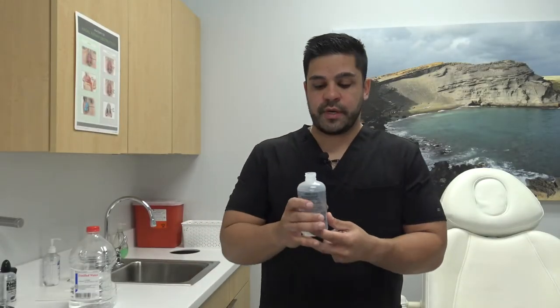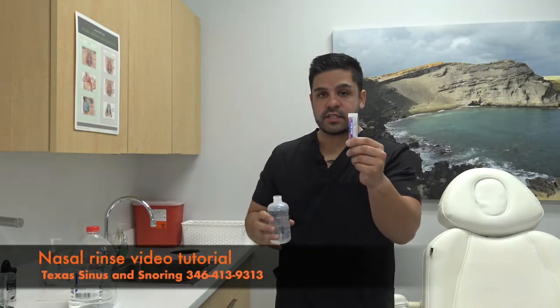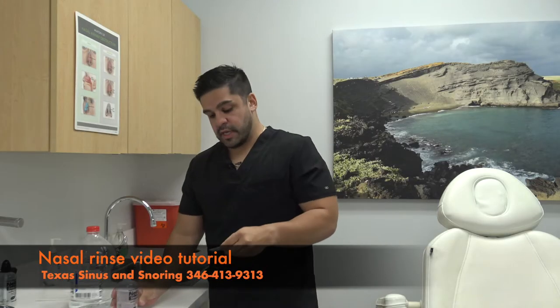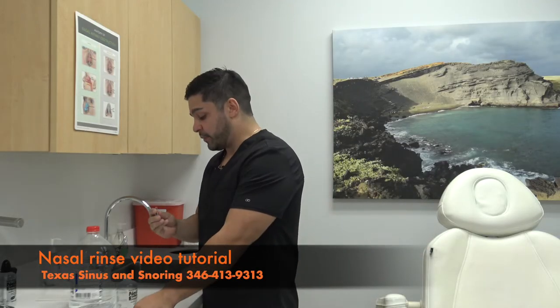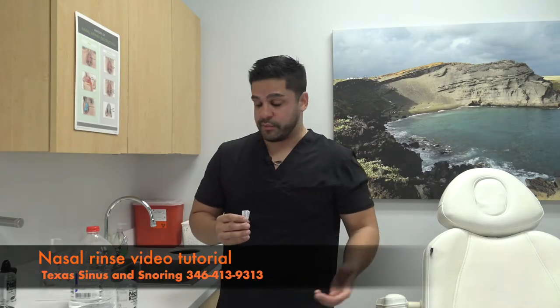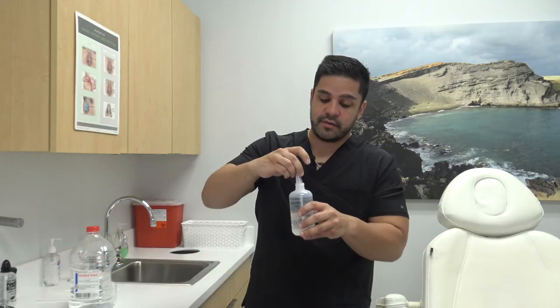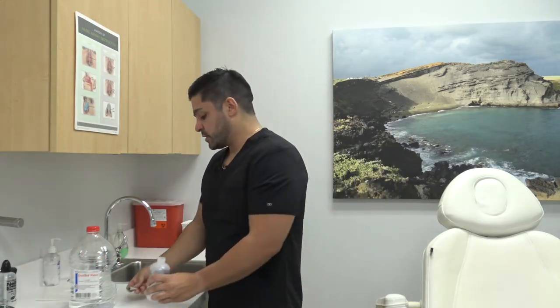Once you have filled the NeilMed Squeeze Bottle up to the black line, you will put one of these salt packets into the bottle. Please do not forget to put in the salt packet. If you do not put the salt packet in the water, it will be very uncomfortable — it will burn and you will not have a pleasant experience. It's very important that you do not forget to add it before using the bottle.